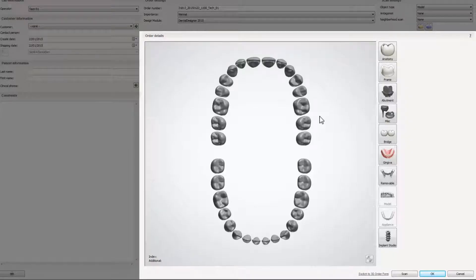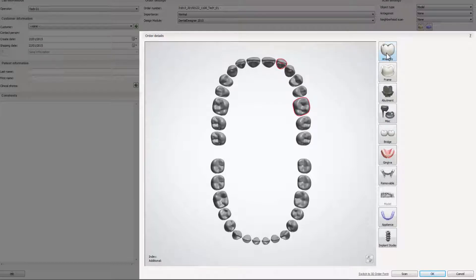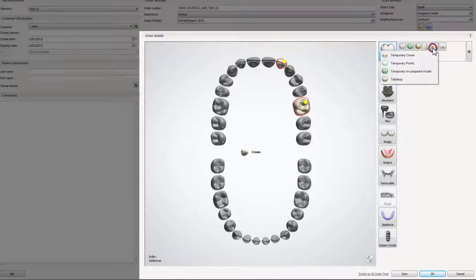To create an order for tabletops or non-prepared veneers, select the teeth you would like to work on in order form. Then click the anatomy icon. Under temporary restorations, you will find a drop-down list which holds the tabletops restoration type.